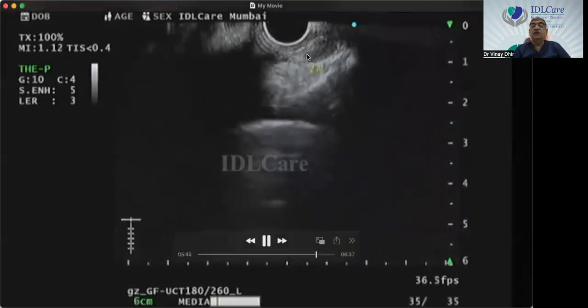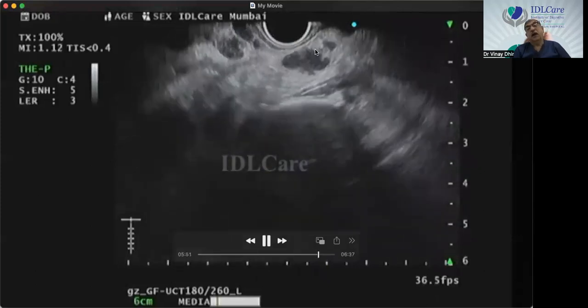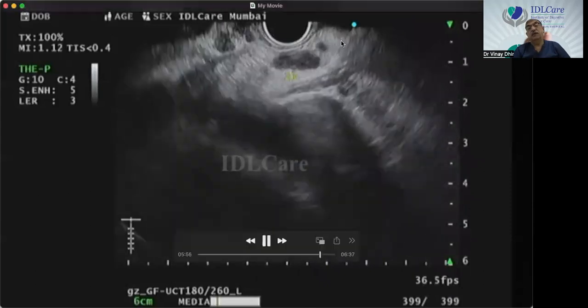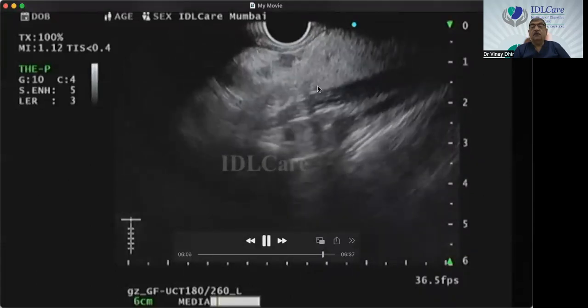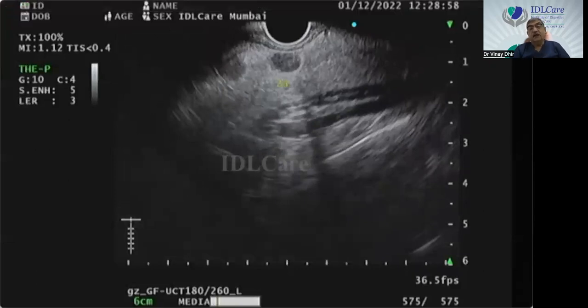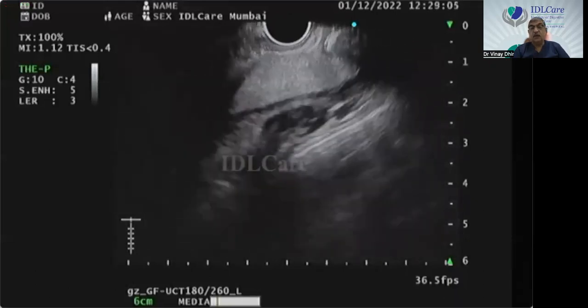As I'm continuing to withdraw, there are many, many more lymph nodes. This is station 2A. So here you will see the prominent arteries of the neck being displayed. The thyroid will be seen. See, this is the thyroid, and you will see the subclavian vein and the carotid artery. So here is the thyroid, lots of lymph nodes in this case. This is the sternocleidomastoid. So I find doing this sagittal EUS very, very useful in my practice.